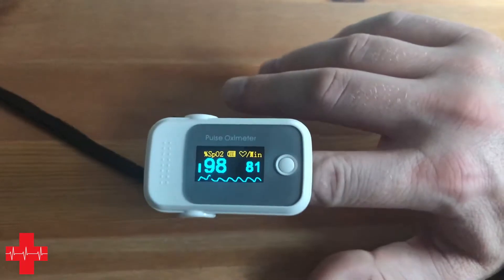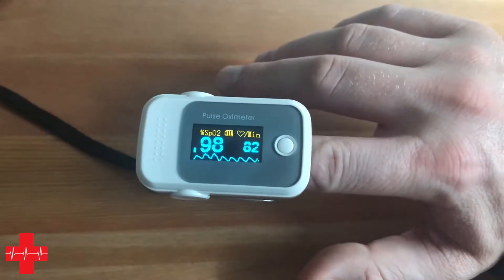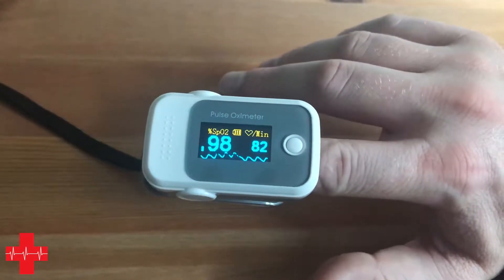Low batteries may contribute to problems as well, but that is fairly unlikely because you'd probably get a low battery warning and most devices tend to just switch off before it comes to that point.